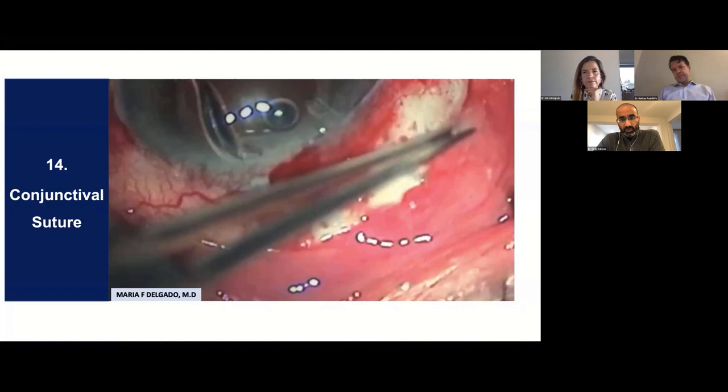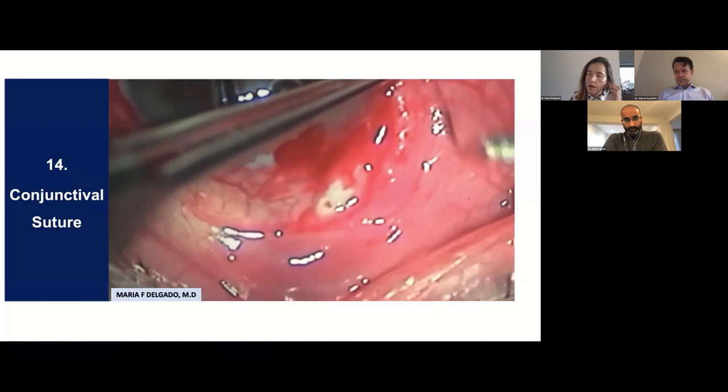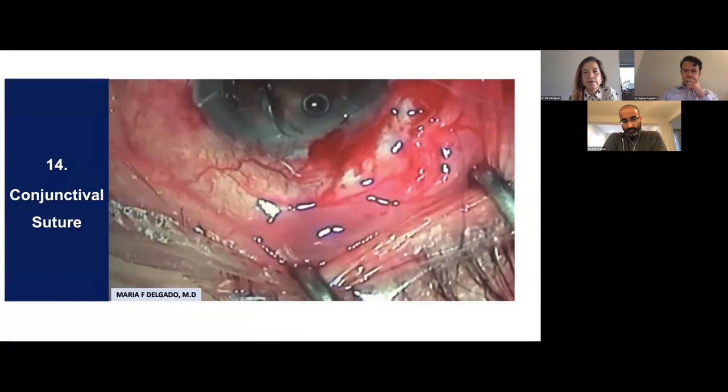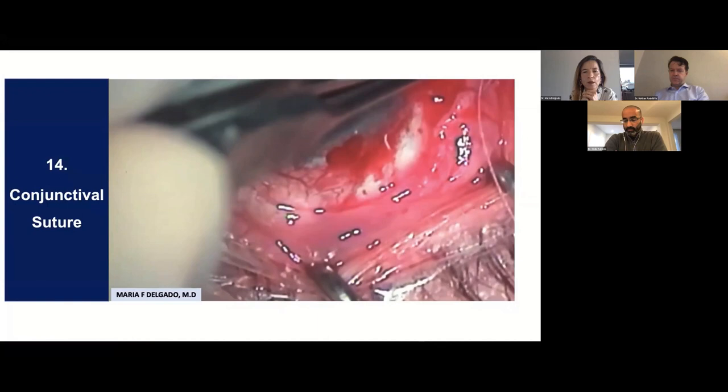Yeah. So the conjunctival closure, I'll do it with the Vicryl, with the same suture that you did the bridle suture in the cornea, which is routinely probably a 7-0 or an 8-0. And this case, for example, does not have a patch actually. So you just make sure that you tie the edges. I don't make a continuous suture. When you cover the limbus and you approximate the edges, it goes pretty well, and in most of the cases, you don't have any issues with that.